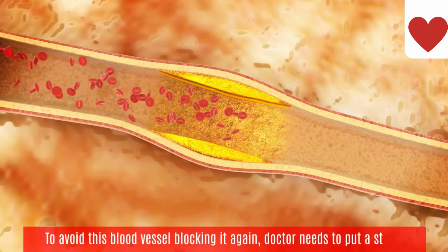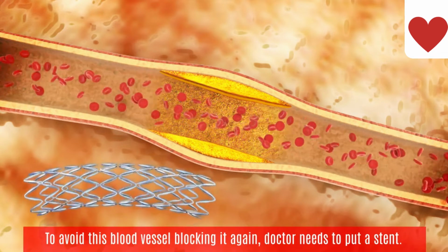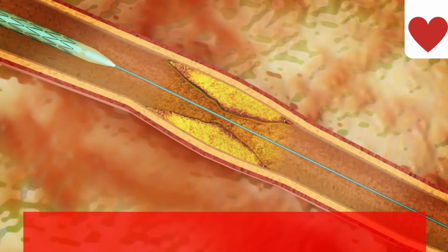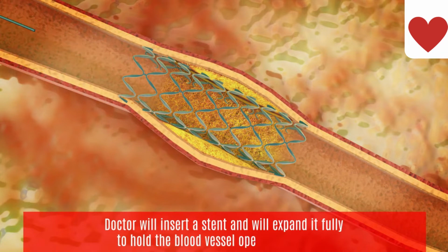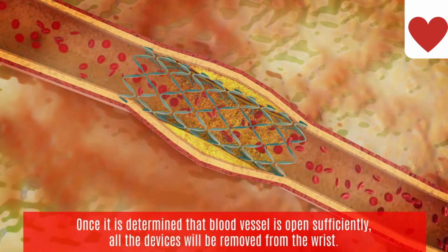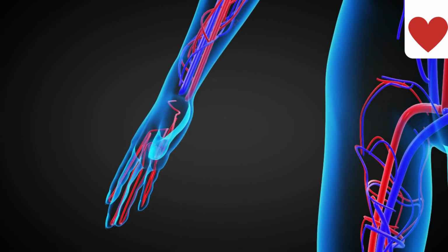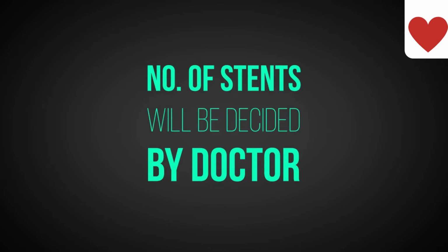Now, to avoid this blood vessel blocking again, the doctor needs to put a stent. The doctor will insert a stent and will expand it fully to hold the blood vessel open permanently. Once it is determined that the blood vessel is open sufficiently, all the devices will be removed from the wrist. The number of stents will be decided by the doctor as per the number of blockages in the blood vessels of the heart.